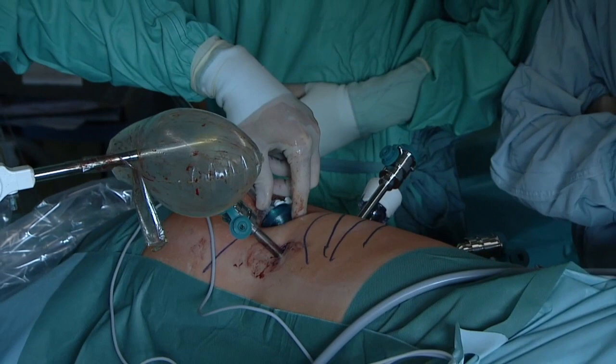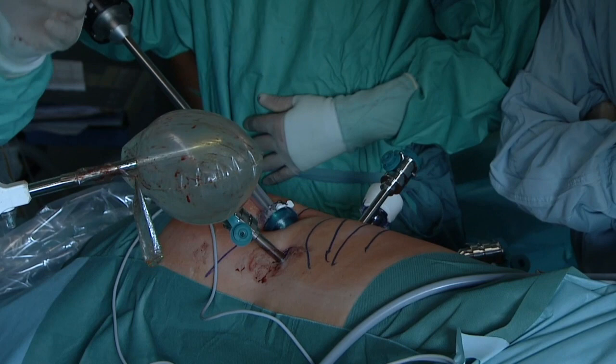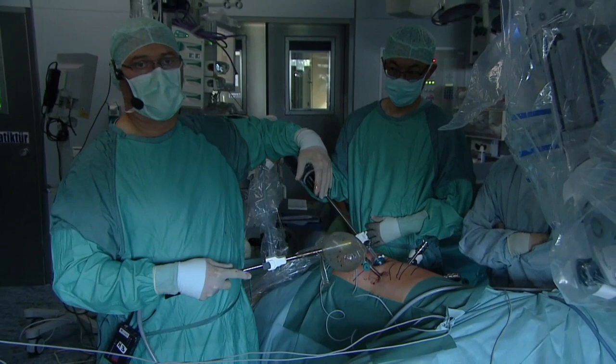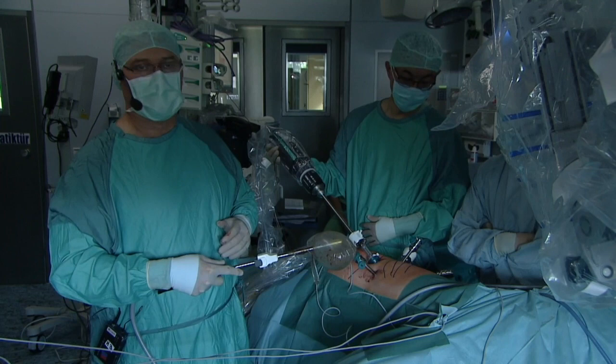Now remember, with the Da Vinci SI, and this is a lower pole tumor, so we have to move our ports back, because one of the problems robotically, especially with lower pole tumors, is that the instruments have a hard time getting back to the lower pole. So we're moving everything back lower in the retroperitoneum today to try to get to this tumor. And we still may have some issues because it's a very large tumor.